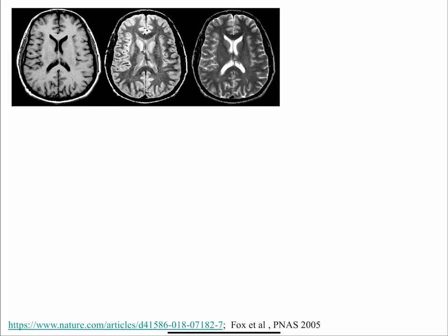And then what we're going to work up to is understanding that with a single MRI system, you can come up with hundreds and hundreds of types of images, lots of different information. Other modalities have that to a certain extent, but I think MRI outpaces all the others in how much information you can get out of the body. The most common use of MRI, obviously, is to get really nice pictures of the body, and then we'll talk about how to diagnose disease with these pictures. This is the same brain, just with different parameters, and each parameter highlights something different about that brain. Just by changing the software, we get these three different pictures.